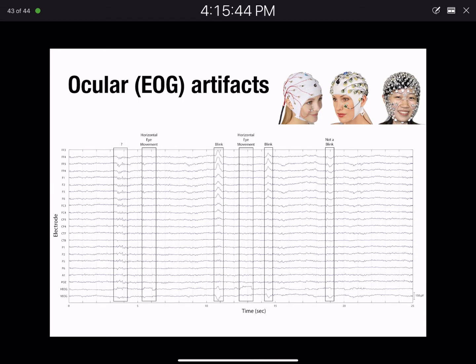So in terms of thinking about the time locking, all you know is we know when the sentence came on, but we don't know when they read the third word in that sentence. So in a sentence processing experiment, we'll use what we call RSVP, or Rapid Serial Visual Presentation, which is just presenting each word in the center of the screen, one after the other. And so they don't have to move their eyes, and we know the onset of each individual word in the study quite well. So anything like that.